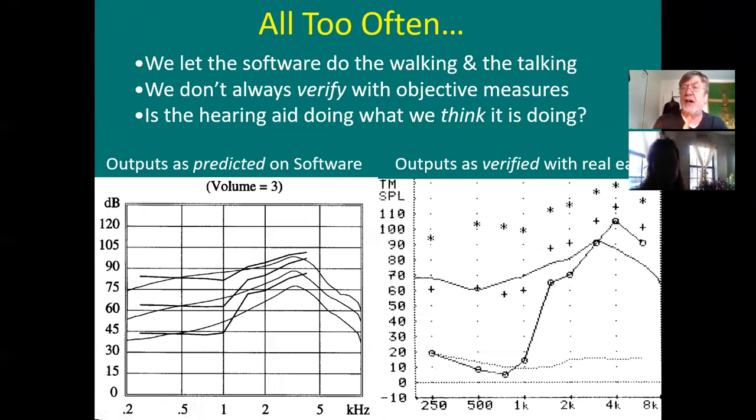However, when you verify with Real Ear, let's just pick on the middle one, the ones around 60. Let's look at this guy right here. Well, when you do, okay, here's the normal hearing. Here's the hearing loss, a real precipitous high frequency hearing loss. Here's loudness tolerance levels, the asterisks. Here's DSL-4 targets, which is too much, admittedly. Even DSL-5 would admit that.